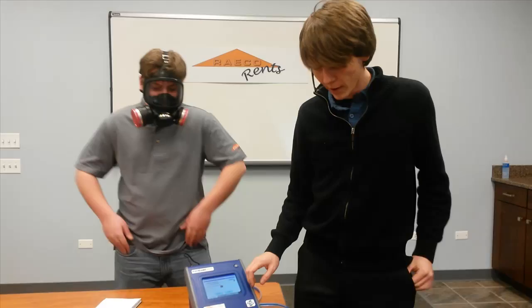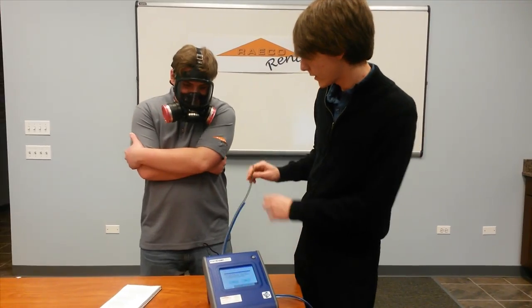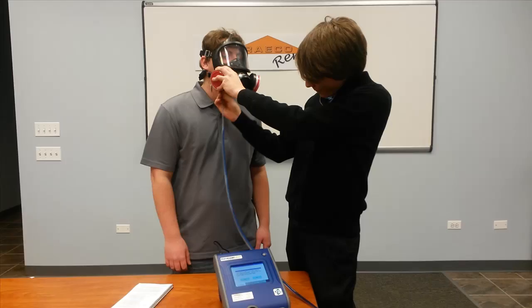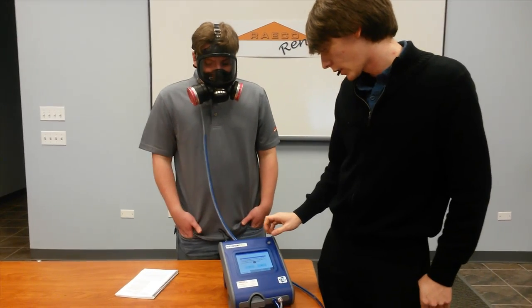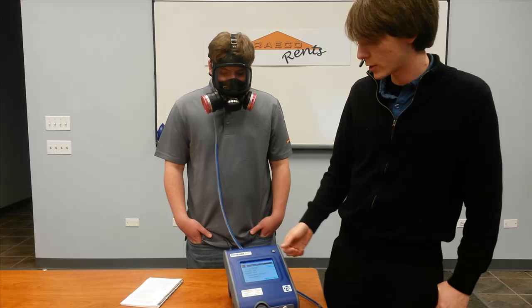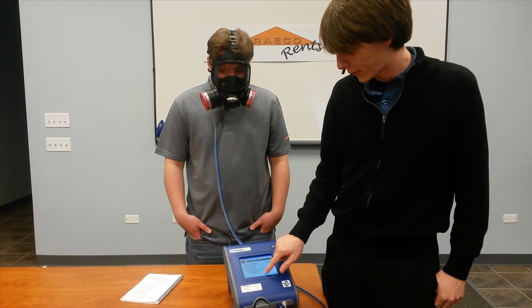Once it loads up, press exit and get the tubing connected to the respirator. It's going to have you pick the person who's going to be tested, so you just select them from the drop down menu and press the next button.